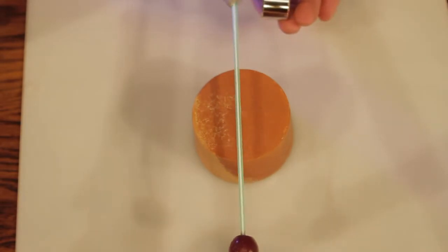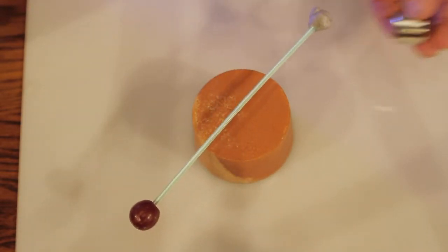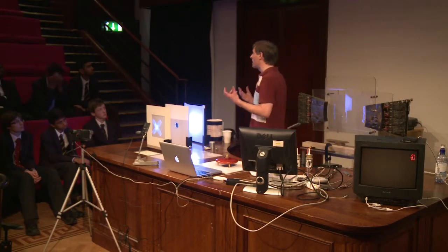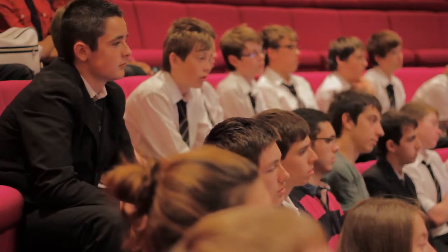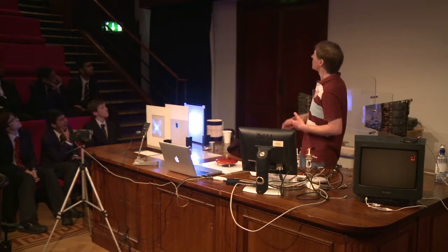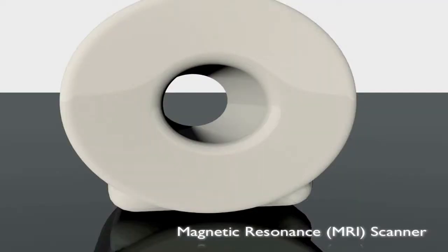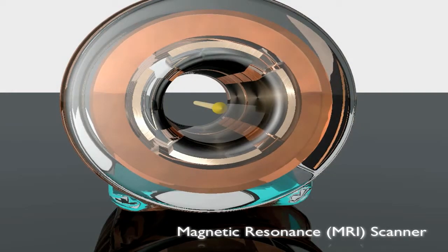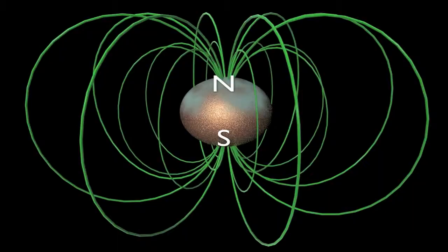In fact, everything can be magnetized, even our bodies. They're magnetized because they've got charged particles that are spinning around in some way within that material. If we put our bodies inside a huge magnetic field, like the one you have in a scanner like this, let me just show you what's inside it. There's a huge electric current that flows around the outside of this thing, and it creates a whopping great big magnetic field. If you put your body inside that, you will become magnetic, partly because you contain spinning charges, some of which are protons, and they're the ones that interest us.